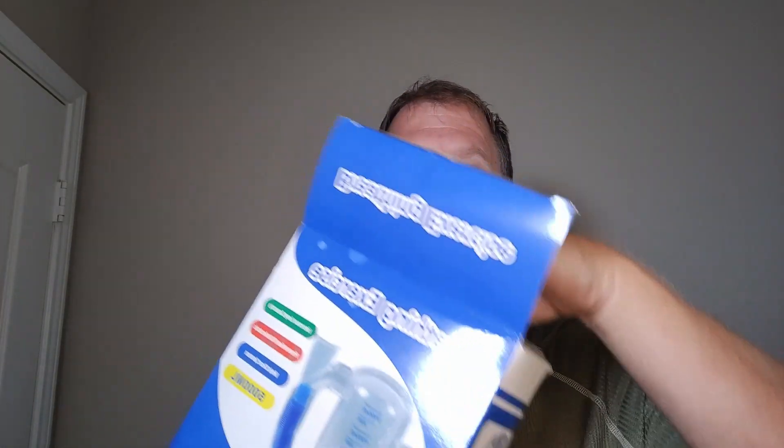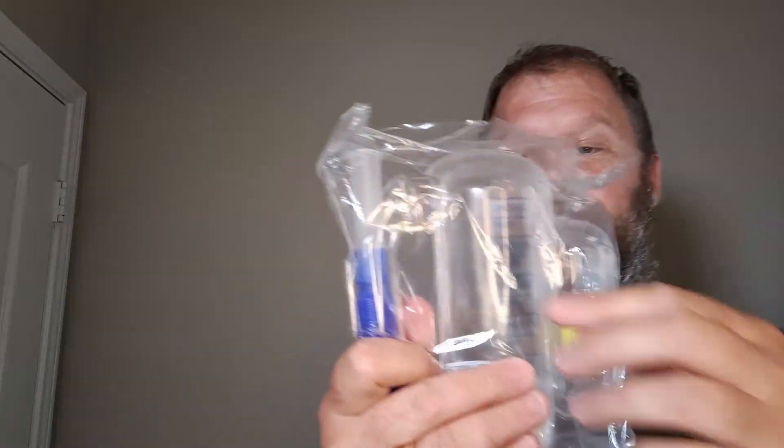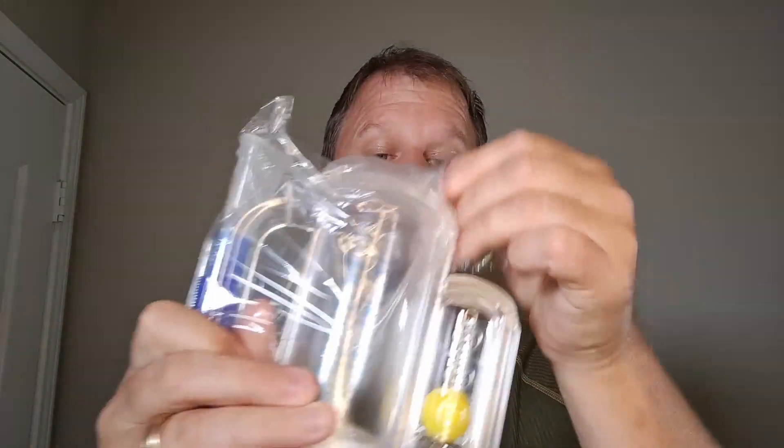Hey everybody, hope you're having a great day. We are going to do an unboxing review of this breathing exercise apparatus, otherwise known as a spirometer, an incentive spirometer. I remember using one of these as a kid in elementary school, but this is a medical device to help train your lungs.